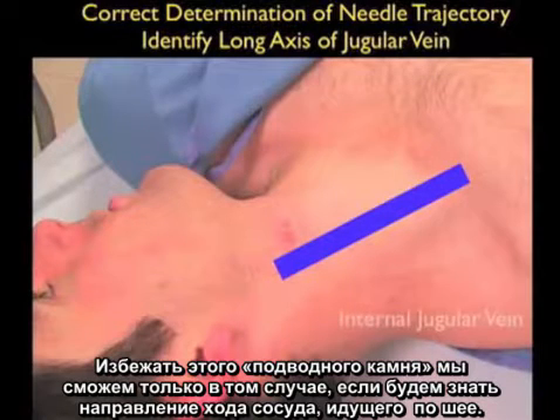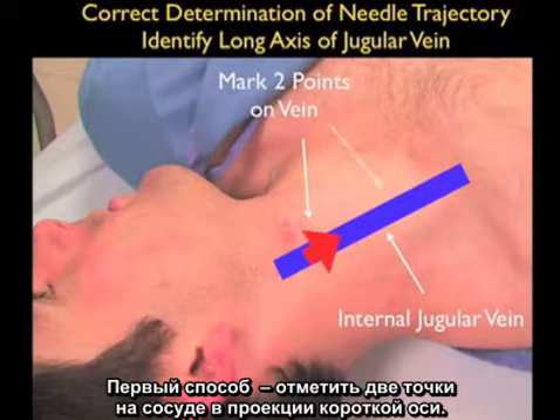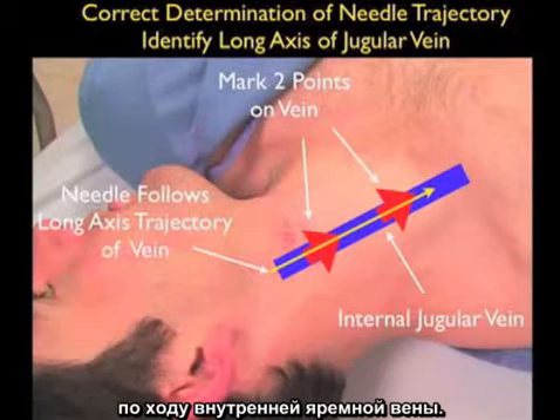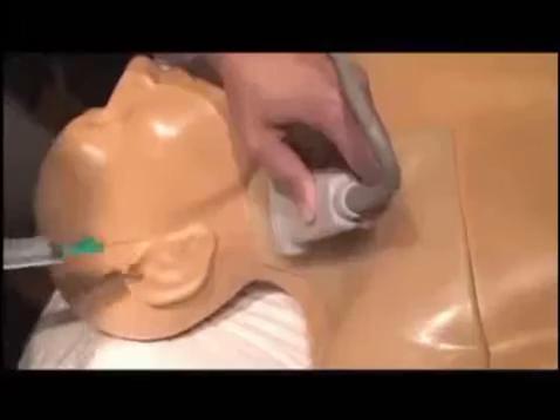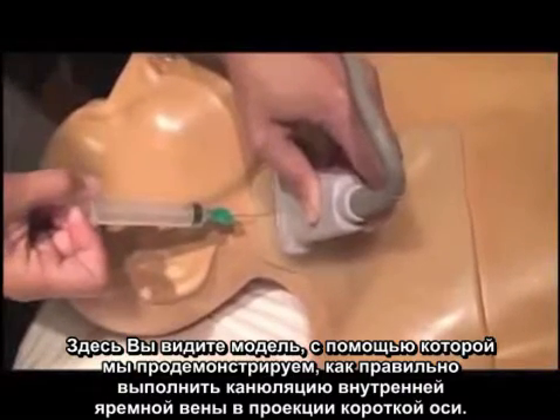The solution to avoiding this pitfall is to know the course of the vessel as it runs up and down the neck. We can do this in two ways. The first is to mark two points on the vessel using the short axis configuration — the needle would then enter at that distal mark and aim towards the proximal mark, passing along the course of the internal jugular vein. We can effectively do the same thing by passing the probe in the long axis configuration and knowing how the needle should pass from the top of the neck down towards the chest. Here we use a simulation model to show the correct approach for a short axis cannulation of the internal jugular vein.